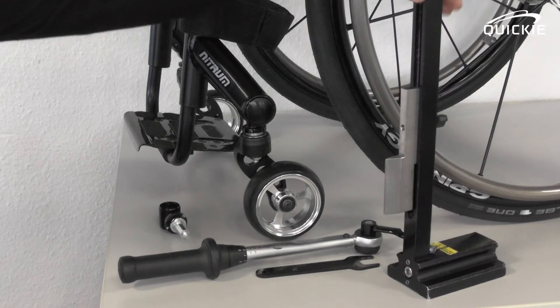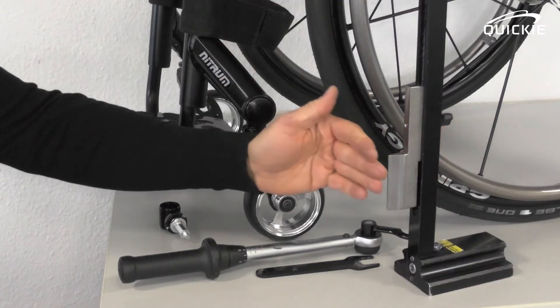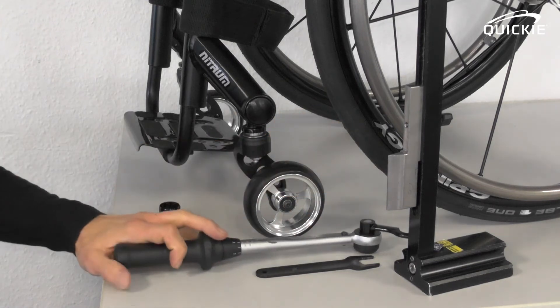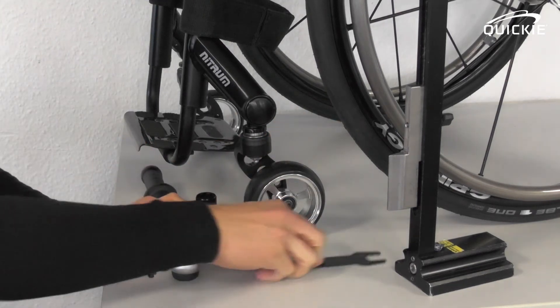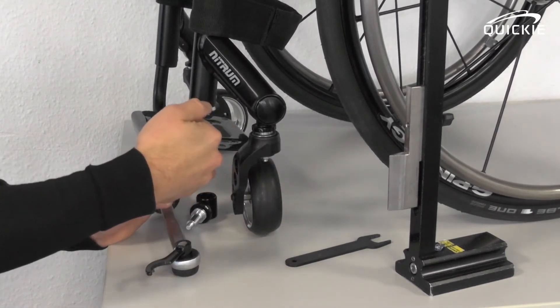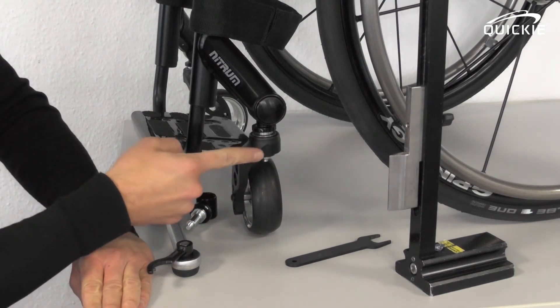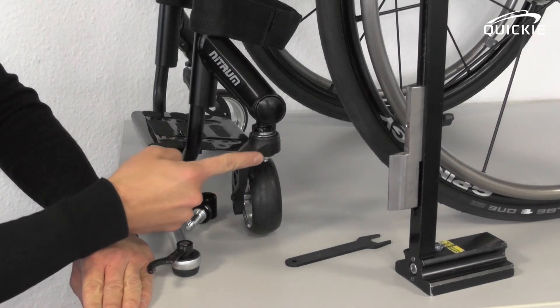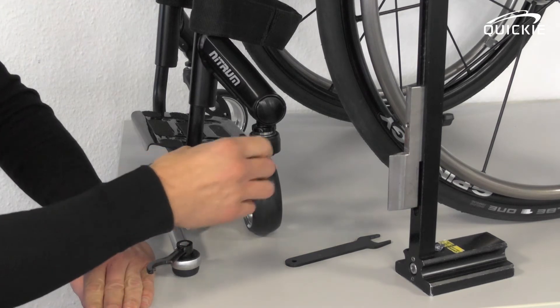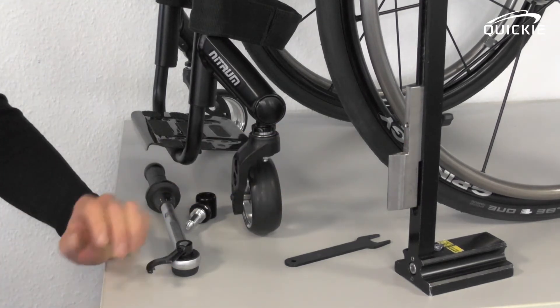We are using a special gauge for that. The only reason for that is that it indicates a 90-degree angle to the floor, which is what you need. Turn the caster wheel so that it's facing inwards, and look for the flat spot on the caster fork. On that type of fork, it's here. On a dual-arm fork, it's in exactly the same position.